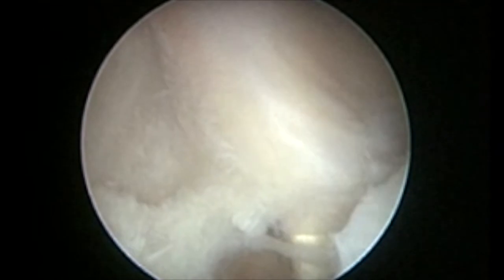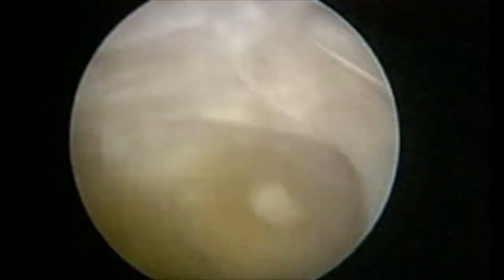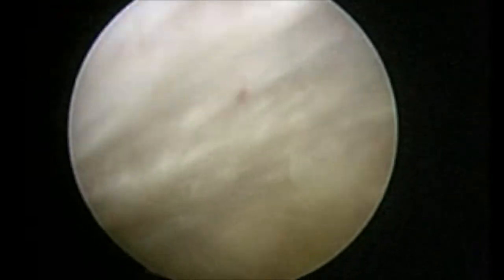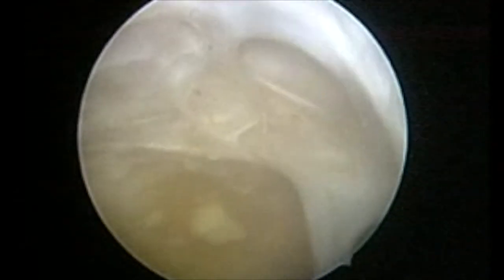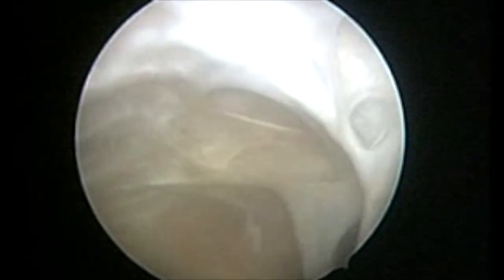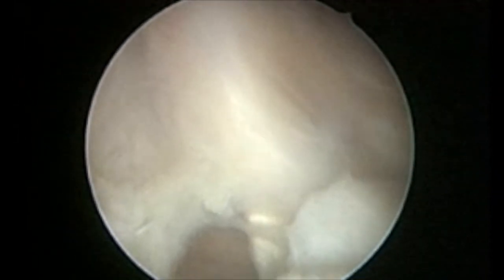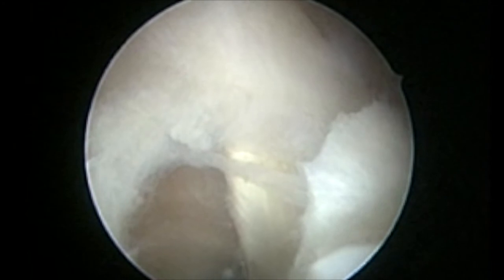Once the opening is large enough, one can enter into the popliteal cyst directly and inspect the septa and the cyst wall. In case there are multi-lobulated cysts, the septa can be divided using a cystic portal directly, although that is not very often required. Through the opening, one can often see the medial head of gastrocnemius, as the cyst wall is usually posterior and medial to the medial head of gastrocnemius.